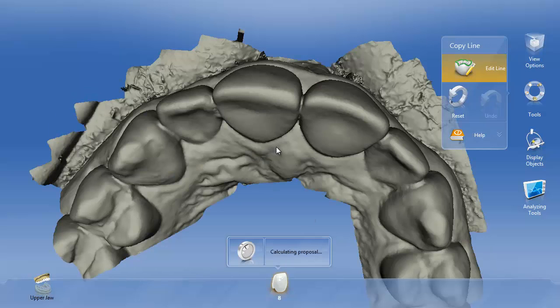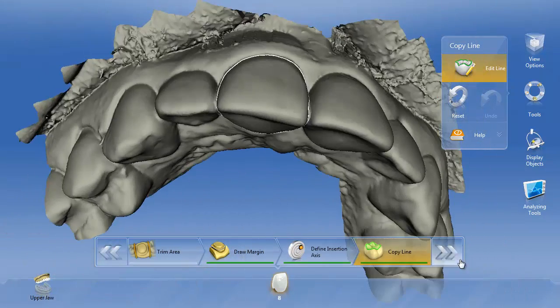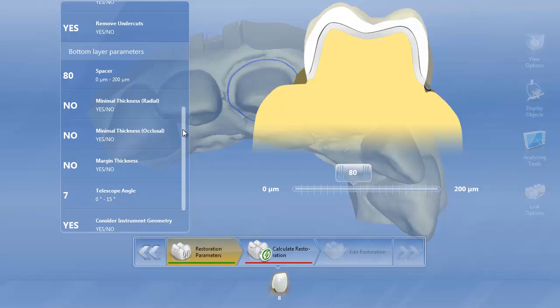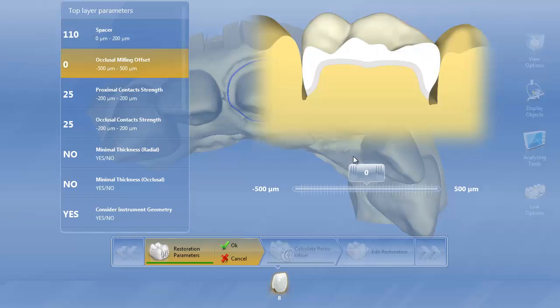We're going to draw our copy line — we're going to biocopy. We can do biogeneric or biocopy; either one will work. Here's my biocopy line drawn. We'll go ahead and move forward and get our parameters. Whenever we do multi-layer we have both top layer and bottom layer parameters. Just consider your top layer parameters as whatever you would have for a normal crown, so I'll quickly go ahead and set my normal crown parameters.